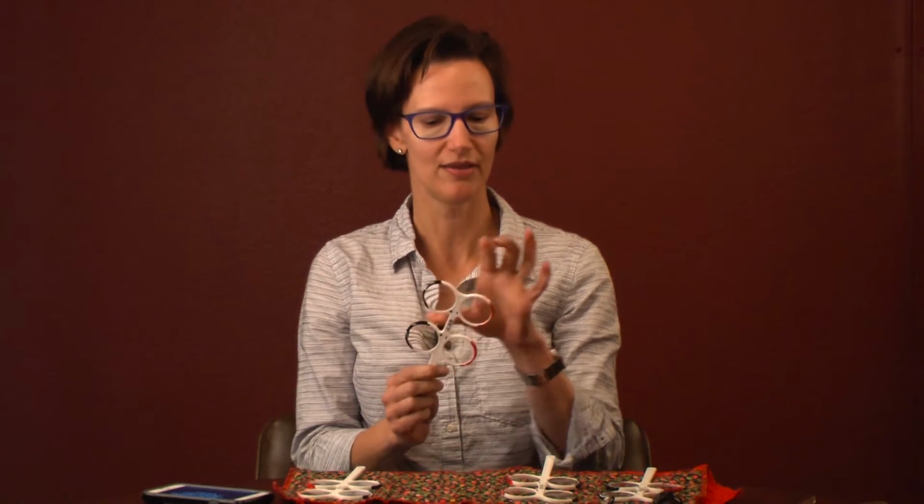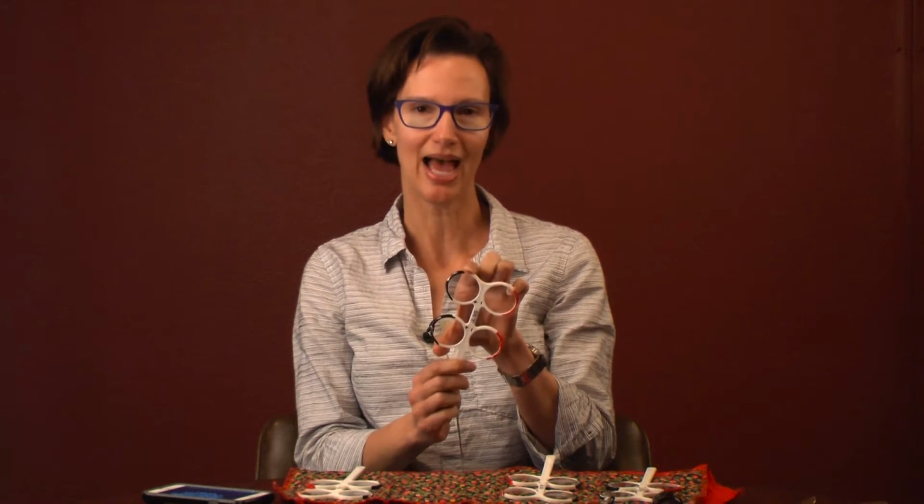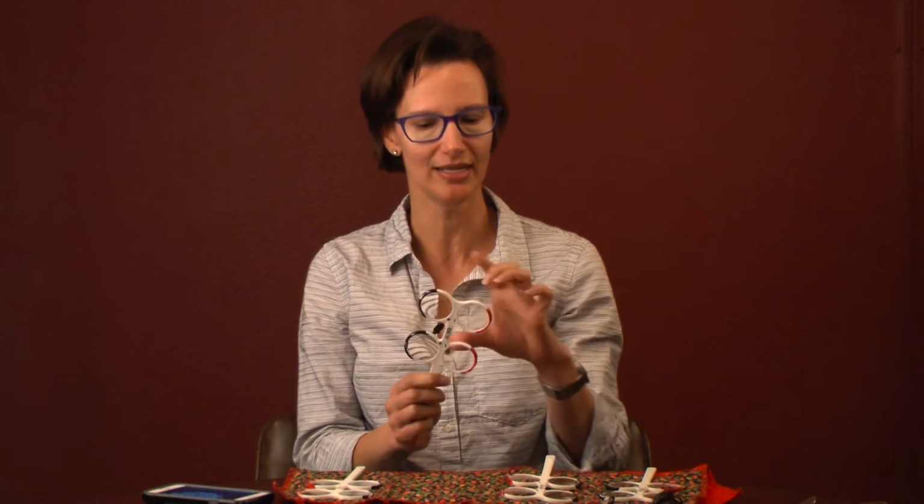They're different strengths. You've got a 0.5 power, a 2.0 power, a 3.0 power, and a 4.25 power. The lenses are colored red or black, depending on if the lenses are negative or positive power. Negative will be a concave lens. The positive, the blacks, will be a convex lens. So the black will make things larger, it magnifies, and the negative will make things smaller.